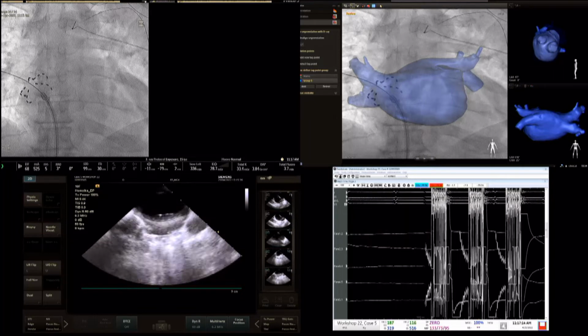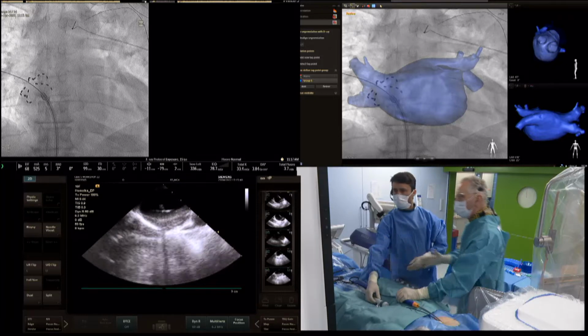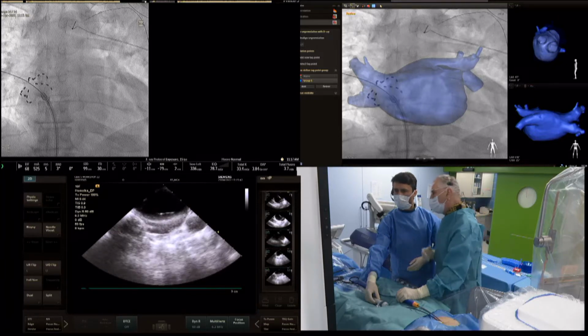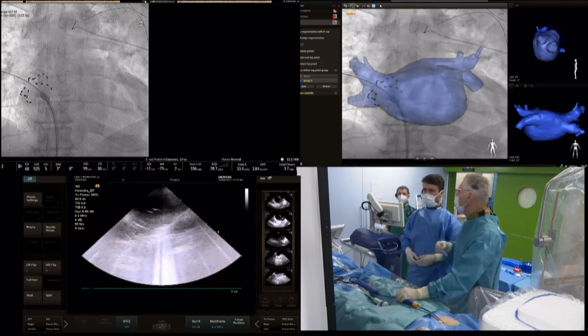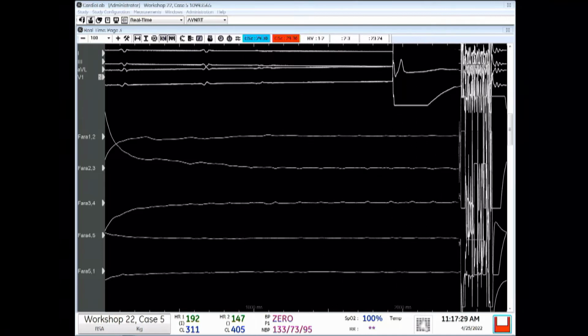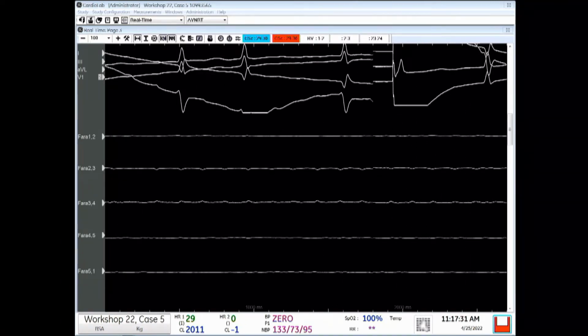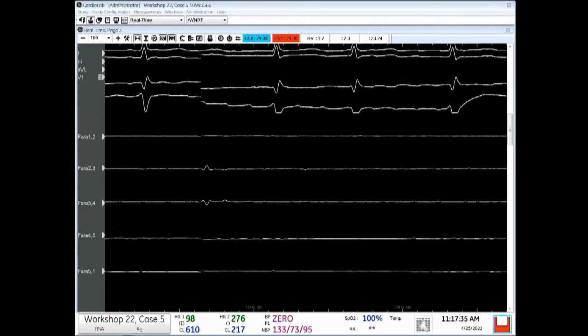And look at the after, look, it disappeared. So it's really, Hiroshi, it's really an acute effect, as you were speaking about. And because we really want to be sure that the lesions are durable, we create 2 + 2, or 4 applications for basket and 4 applications for flower.